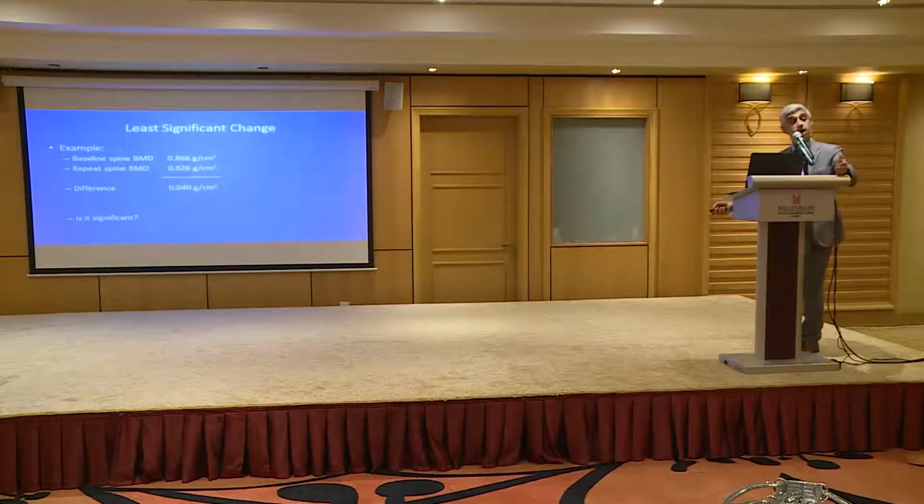So is a 4% loss clinically significant? Then the next thing you should know is the least significant change. So if the patient has lost 4%, and the least significant change at this center is about 3%, does he exceed it or is he within it? So he exceeds the least significant change. That means his difference is true. He really lost 4%. But if he had lost, for example, 2% here, or gained 2%, then that's within the least significant change. That means that's nothing. Okay? So that should be mentioned in the DEXA scan report. When you see it, they should include that. And it should be in all the hospitals in Kuwait.